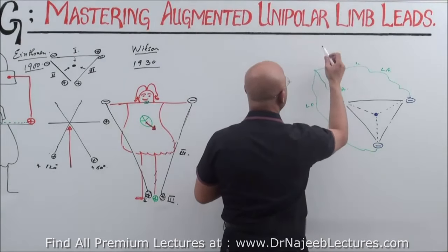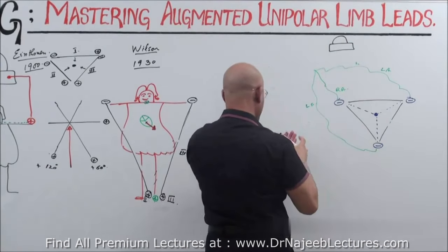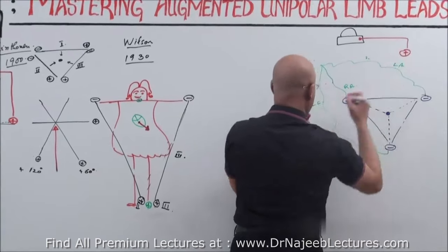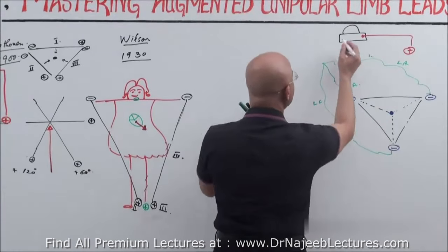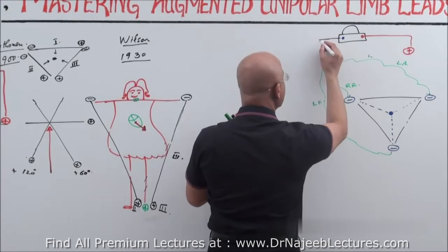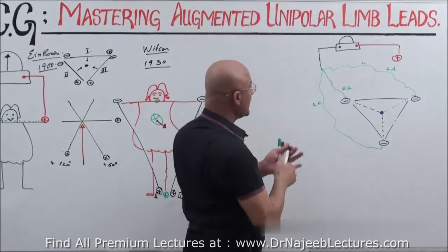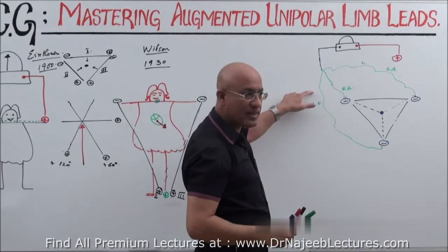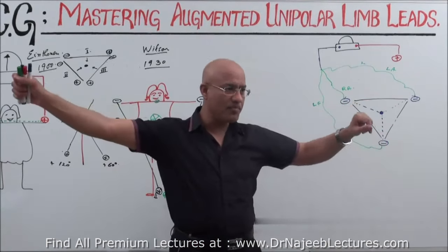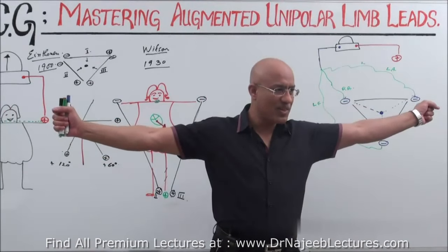Now when we make the machine terminal common, let's look at this. This is your beautiful machine. This is your positive electrode, and here was your negative electrode. And this negative electrode was connected with three wires. These three wires were connected with three electrodes: right arm, left arm, and left leg. You understand it? Yes, sir.